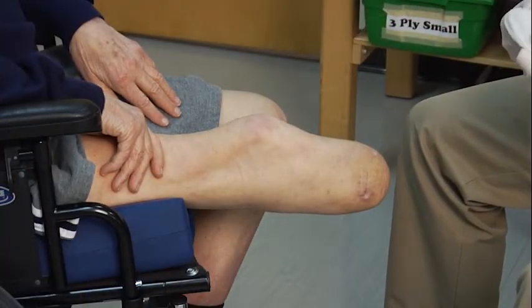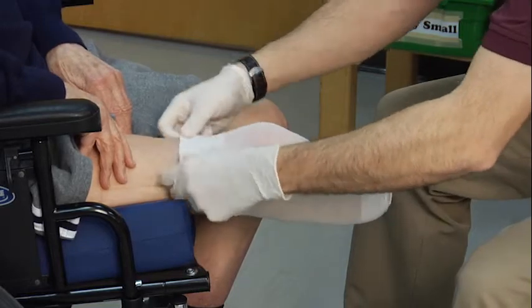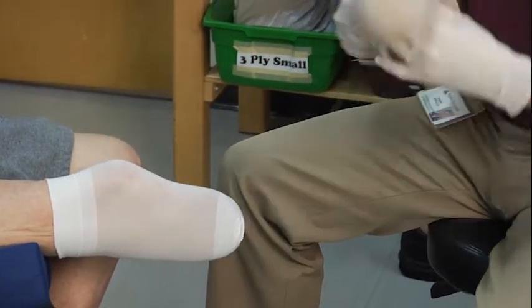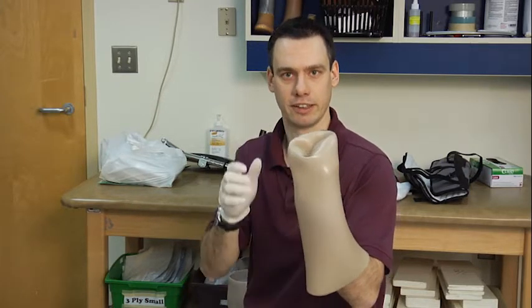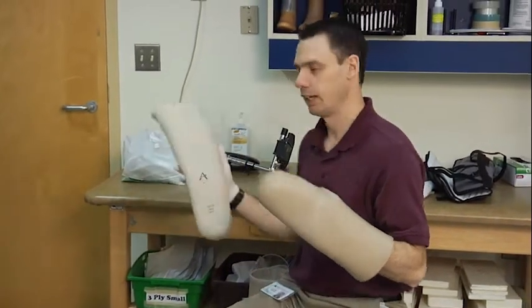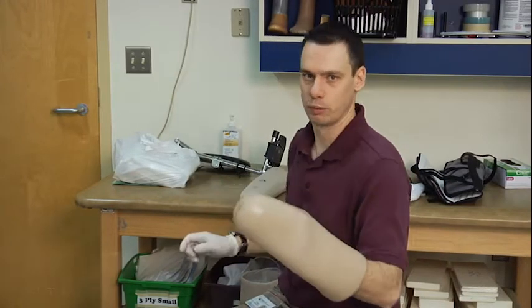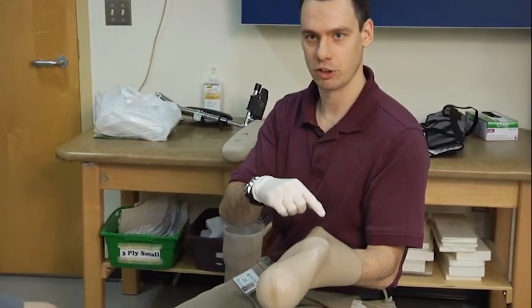Now I'm going to demonstrate how to apply the gel liner to the patient's residual limb. Again, I'm going to apply the sheath to protect that dressing. Next, I'm going to take our gel liner and turn it inside out completely. Make sure the gel liner is completely inside out and not sucked in, to allow space for the residual limb to go into the liner. Also make sure it's clean and free of any debris. Most gel liners have a logo on the front which can be used as a landmark so they know which way is forward. This particular liner has stripes up along the sides which need to go up the sides of the leg.